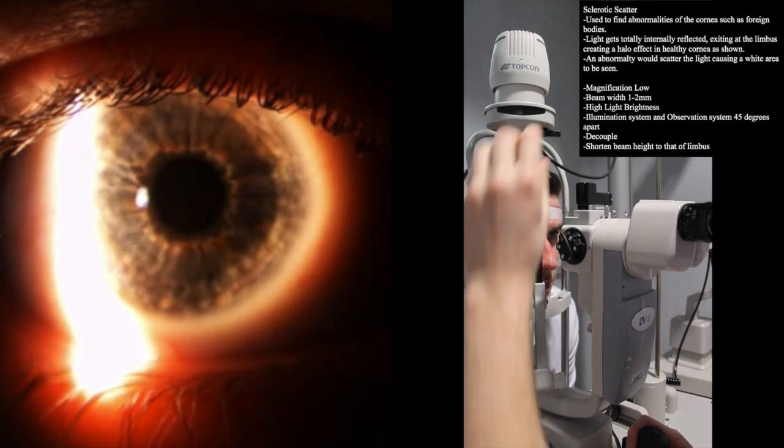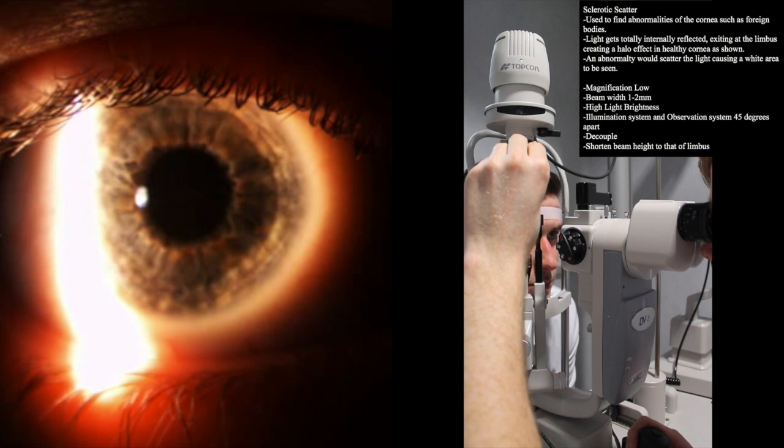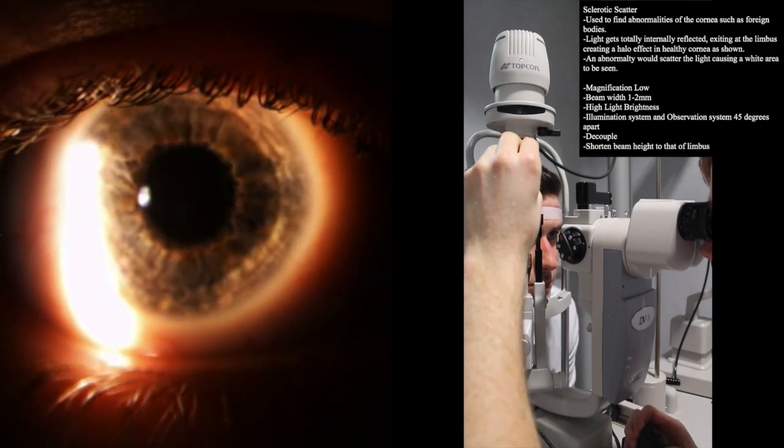Then shorten the beam height so that all of the light is in contact with the limbus, as extra light can be scattered by the sclera, reducing visibility.